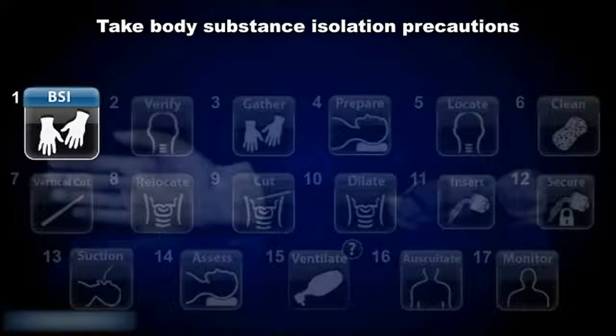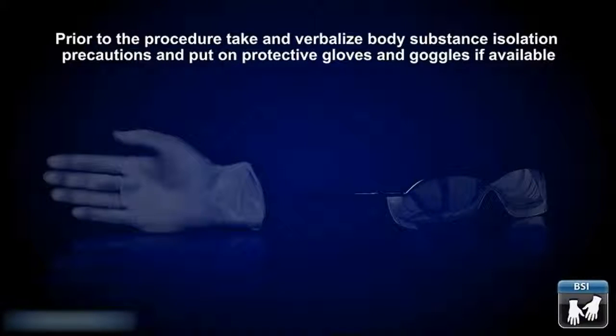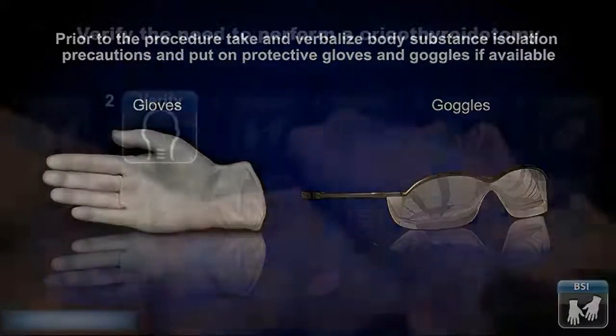Take body substance isolation precautions. Prior to the procedure, take and verbalize body substance isolation precautions and put on protective gloves and goggles if available.